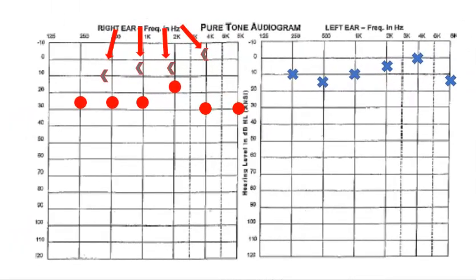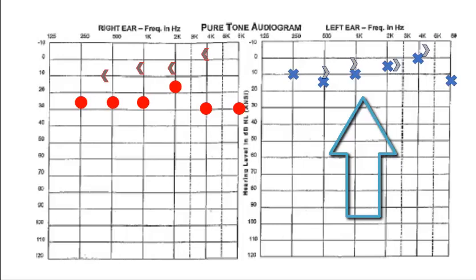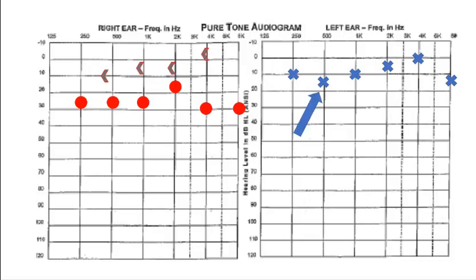We have a mild hearing loss here in the right and good hearing on the left side. We have some unmasked bone conduction thresholds with the bone conductor placed on the right side. But we can't know which ear is hearing these bone conduction responses. It's possible that these bone conduction responses came from the left ear, so we'll need to mask to see what kind of hearing loss is happening in the right ear, because at this point we can't be sure. So the left ear will be our non-test ear, and therefore the ear we will need to mask.